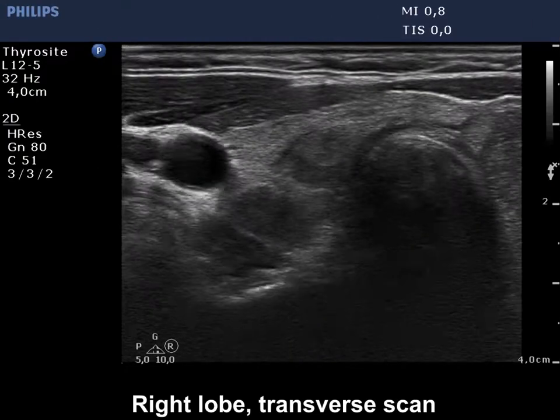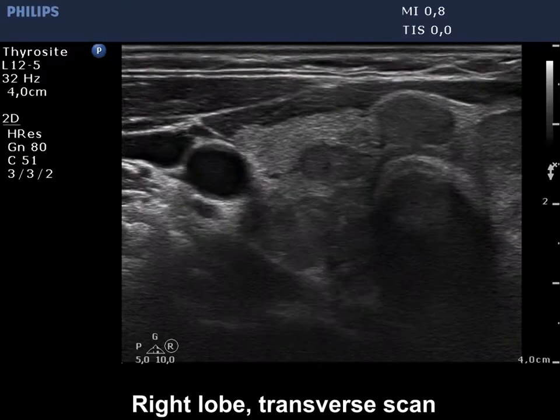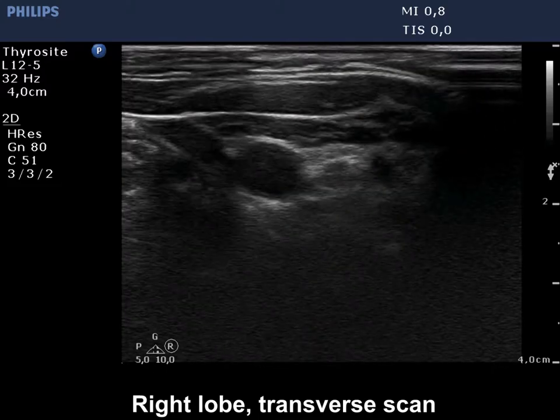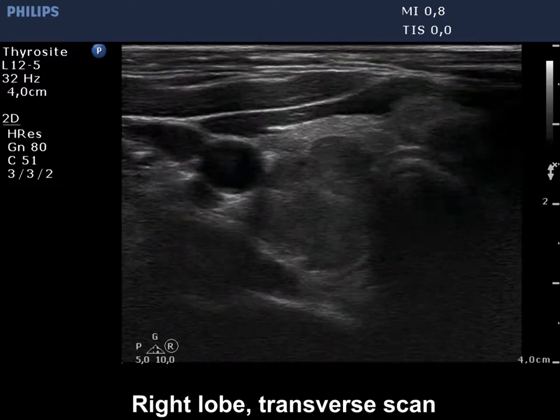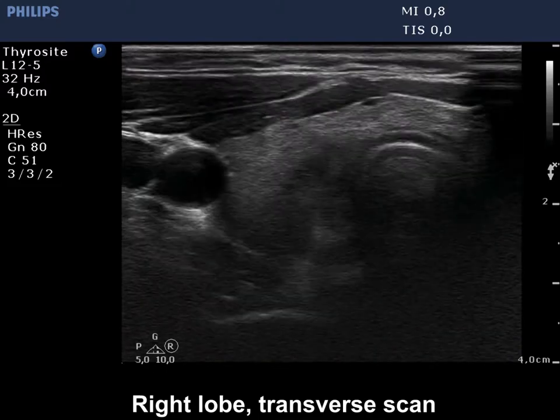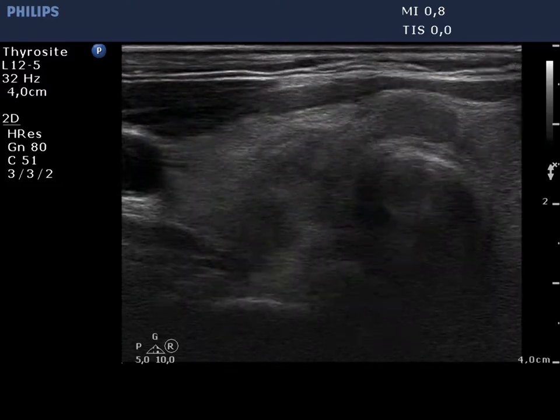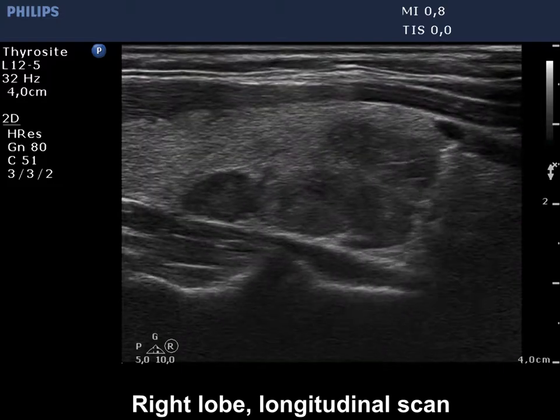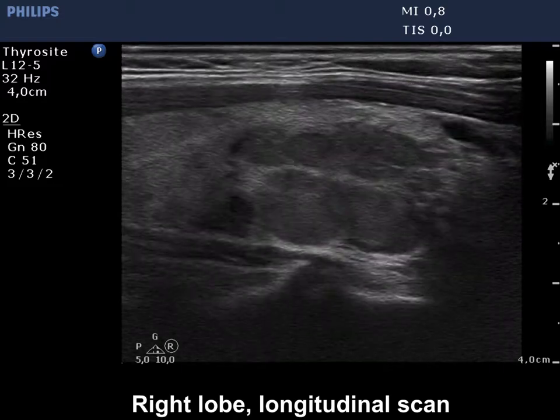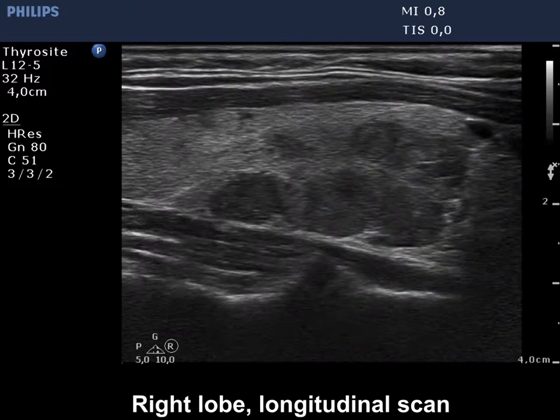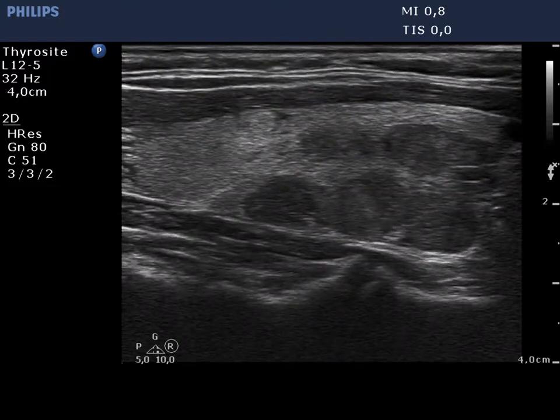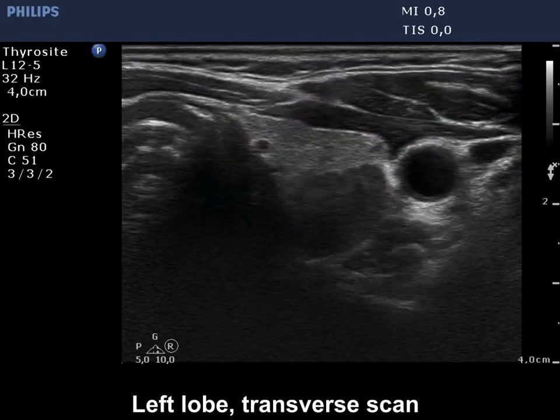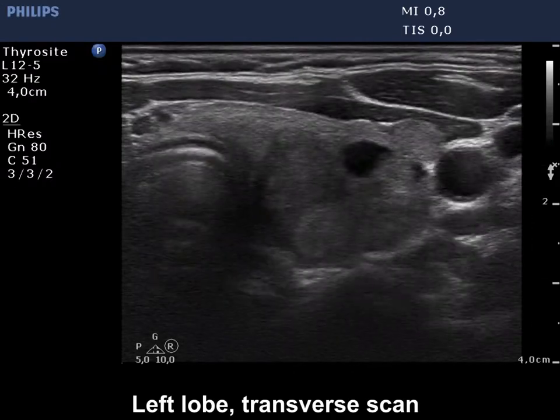The thyroid is composed of several discrete and confluencing hypoechoic areas. The left lobe has a similar presentation.